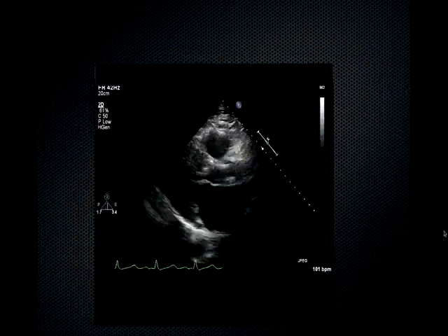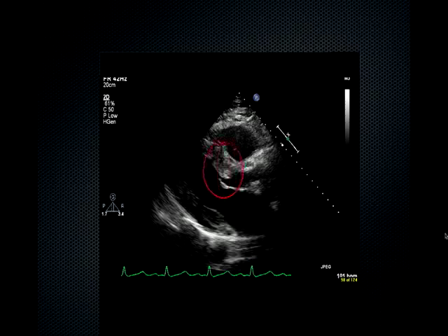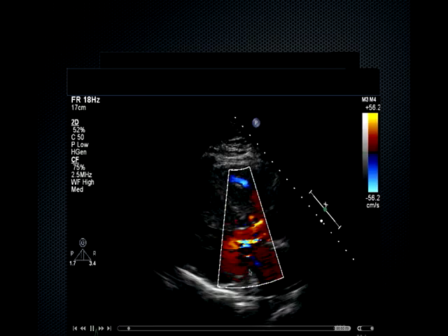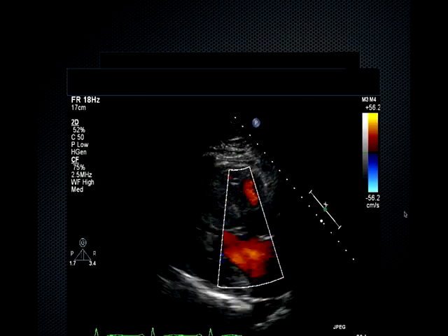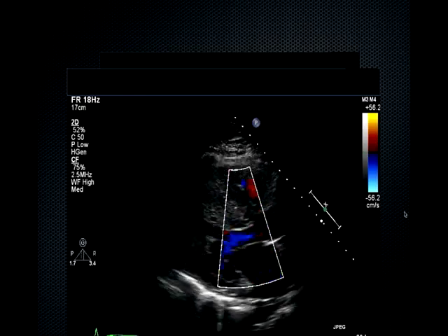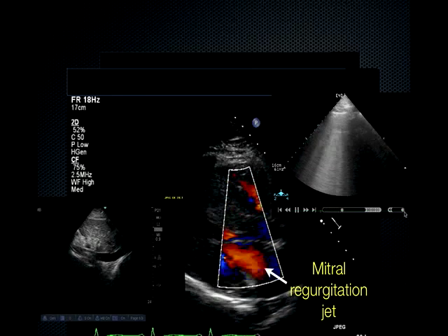From the parasternal long axis view, we see the same thing: a rather thickened proximal septum and an empty chamber. But when we froze during the beginning of systole, we saw that the anterior leaflet of the mitral valve was basically stuck to the septum and obstructing the aortic outflow tract. Putting color across this, we saw the mitral regurgitation, this blue jet right here. So her pulmonary edema was due to mitral regurg from a very empty ventricle, and she essentially was displaying hypertrophic obstructive cardiomyopathy-like physiology with that anterior leaflet of the mitral valve stuck to the septum. We call that hokum.